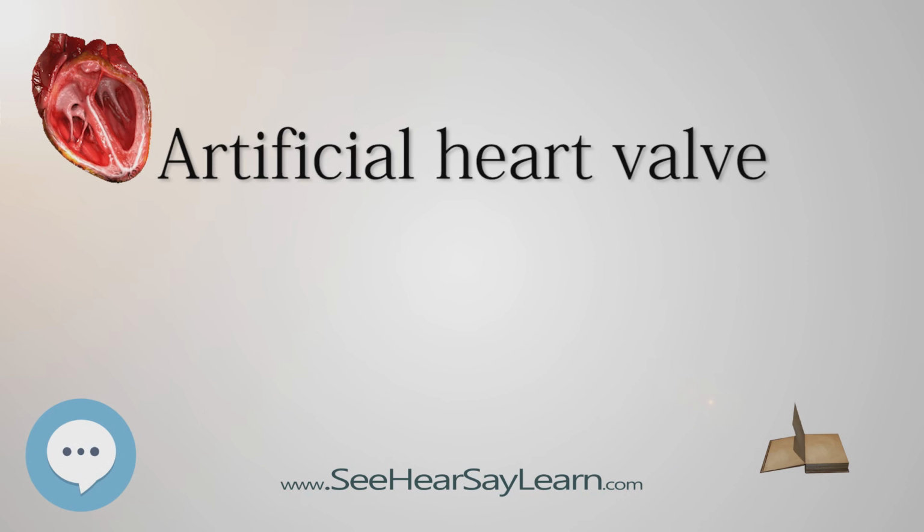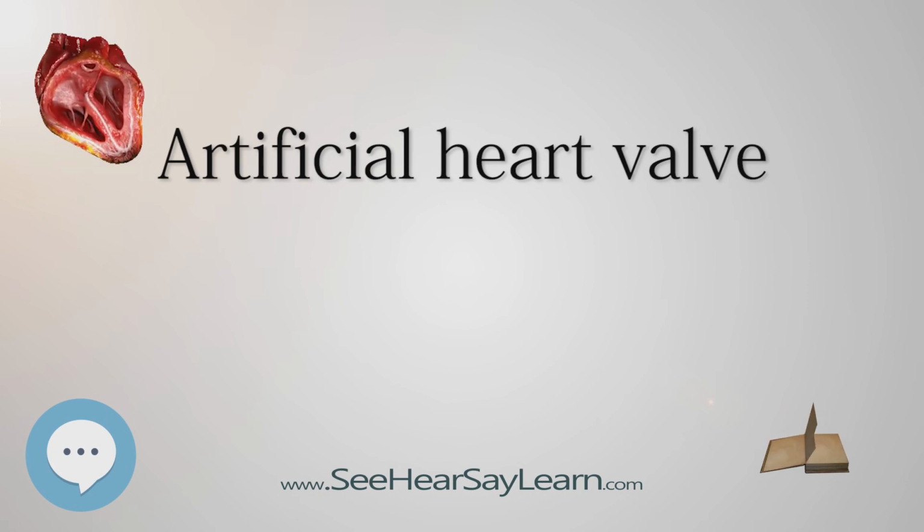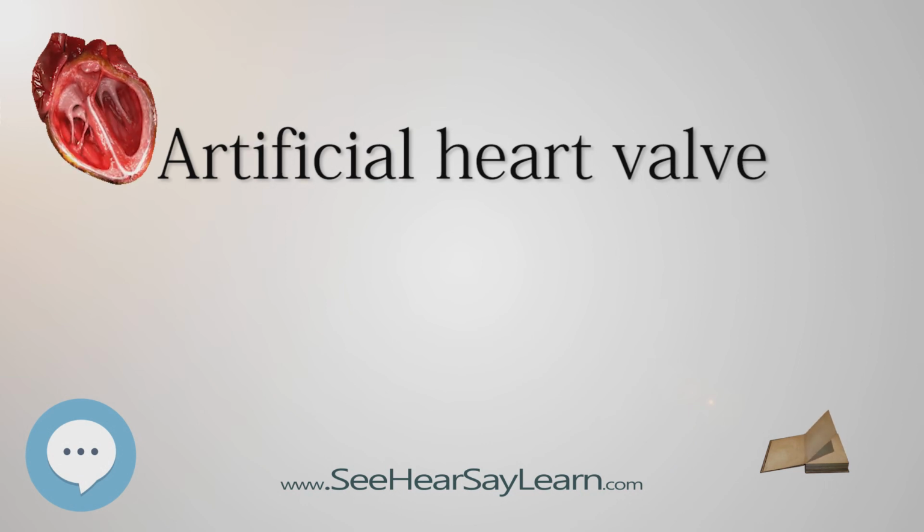At the completion of the heart's contraction, the pressure inside the chamber drops and is lower than beyond the valve, so the ball moves back against the base of the valve, forming a seal. In 1952, Charles A. Hufnagel implanted caged ball heart valves in 10 patients, 6 survived the operation, marking the first long-term success in prosthetic heart valves.